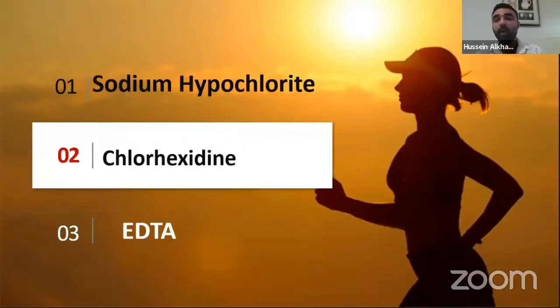Now, let's talk about the most common active irrigation solutions. These are sodium hypochlorite, chlorhexidine, and EDTA.